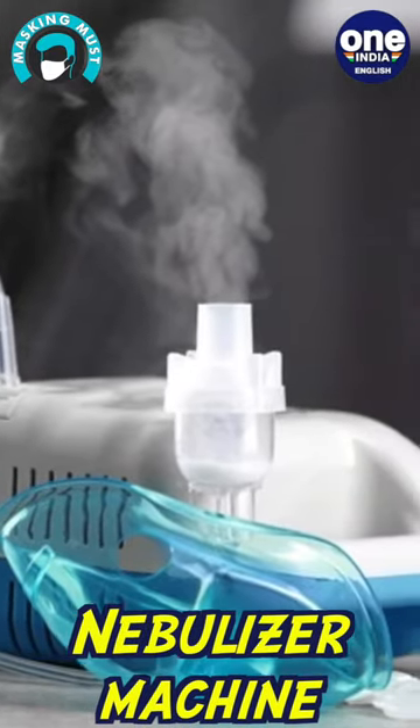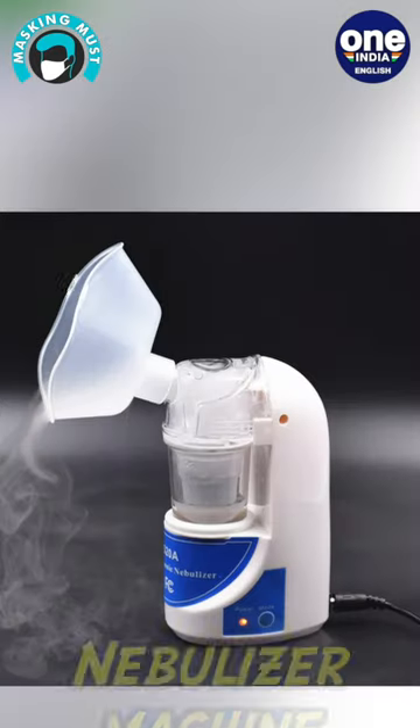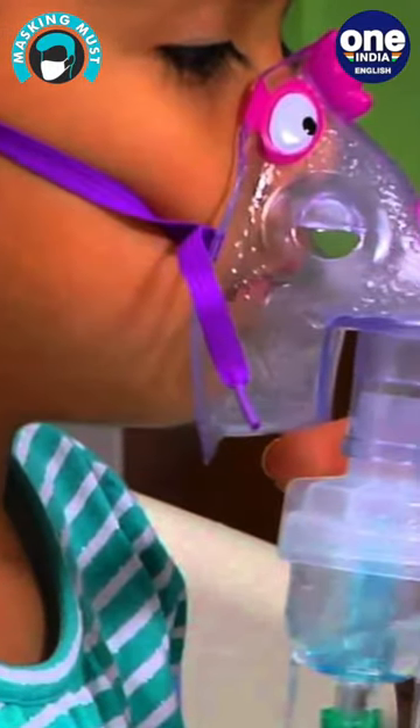A nebulizer is a machine that turns a liquid into fine mist, typically used to deliver inhaled medication. Many use a home nebulizer for care of respiratory conditions amid the COVID outbreak. However, you need to be careful, as the virus may persist in droplets in the air for one to two hours.